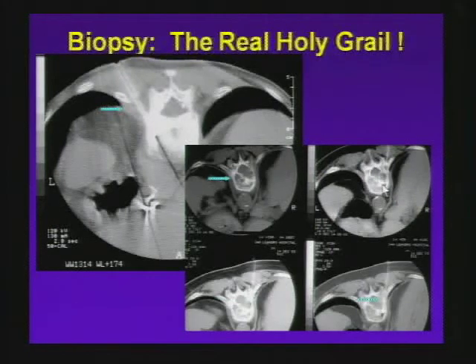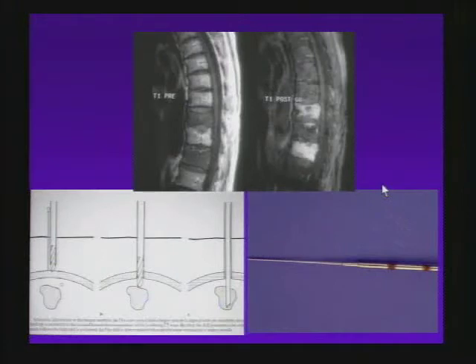And you can go with a needle, you can go extrapedicular, transpedicular. With the needles, it's nice to go coaxial with a little 22, a wire, then a bigger needle, the way we do with nephrostomies or something. And then these bigger needles sometimes have little drills on them, and you can get out big pieces of bone. Once you're in with a big needle, you get lots of samples.